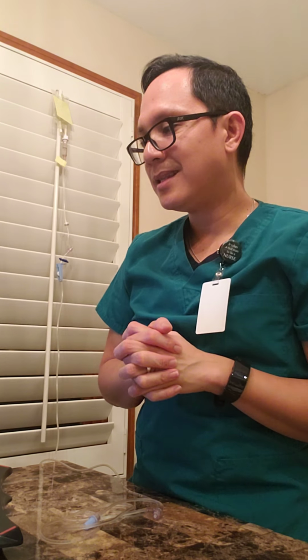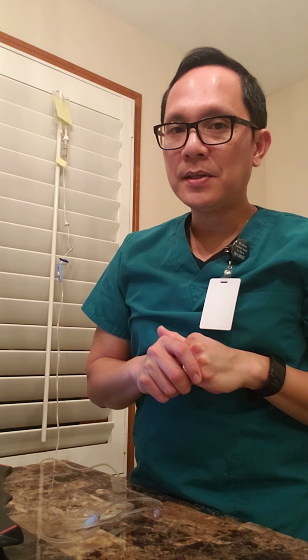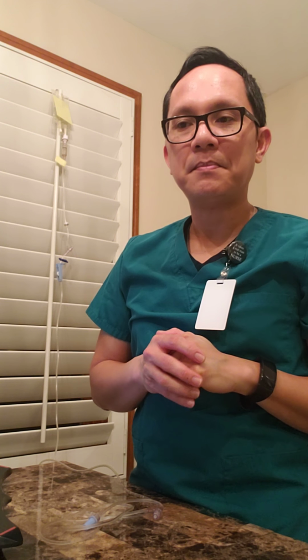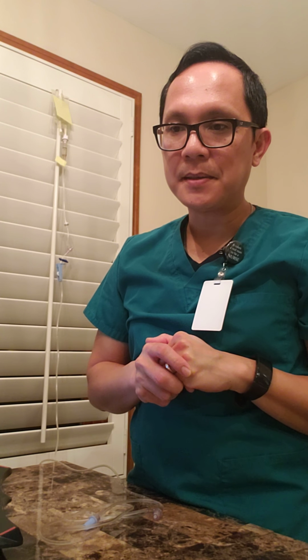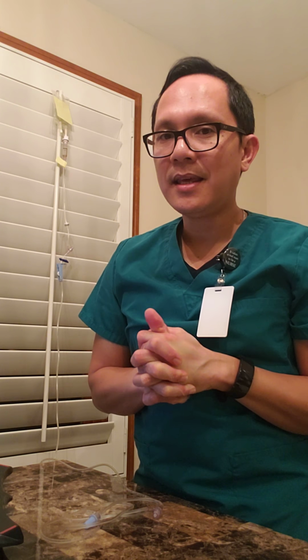I'm gonna wash my hands and open the curtain and make sure that the patient is safe by providing the call button, the tray table within reach, any personal items, the bed all the way low, and side rails up as per facility policy.